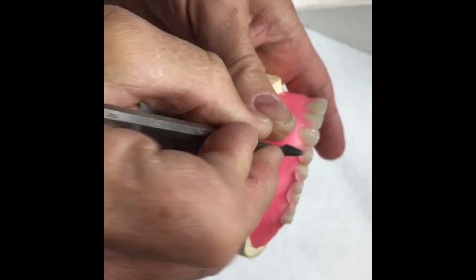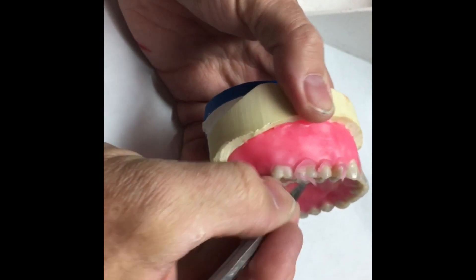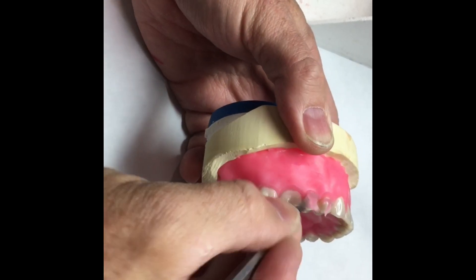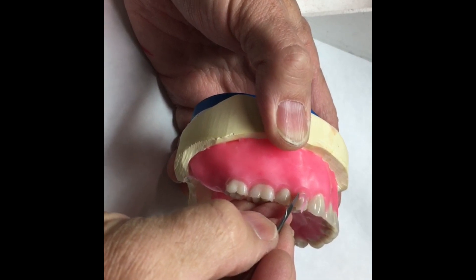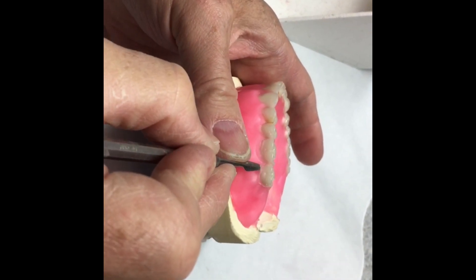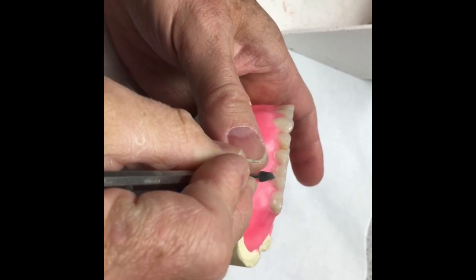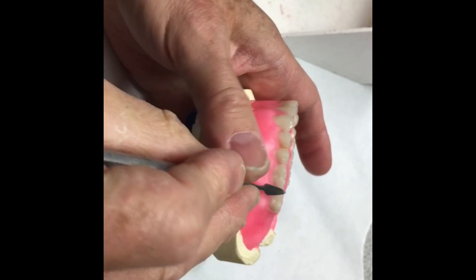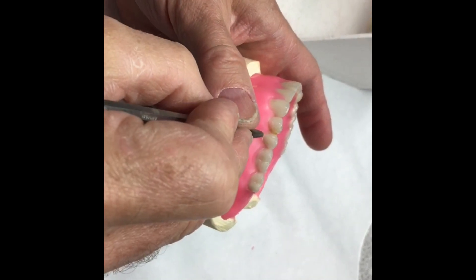If it was for a wax try-in, there would be a base plate and it wouldn't be attached or sealed down at the peripheries. I'm just taking off what I carved away. I want to expose the tooth down below the crest of convexity to help it stay in when we're flasking. Otherwise, it's going to tend to fall out in the boil-out and the teeth may not go back in the right position.